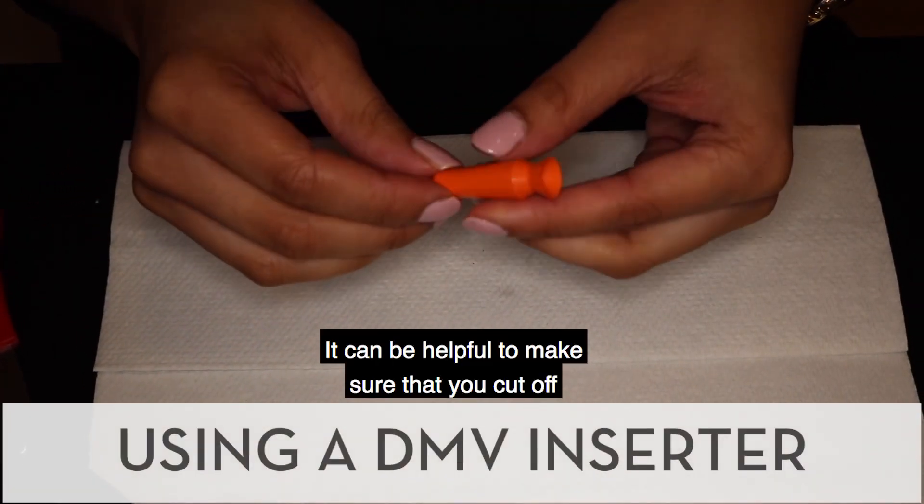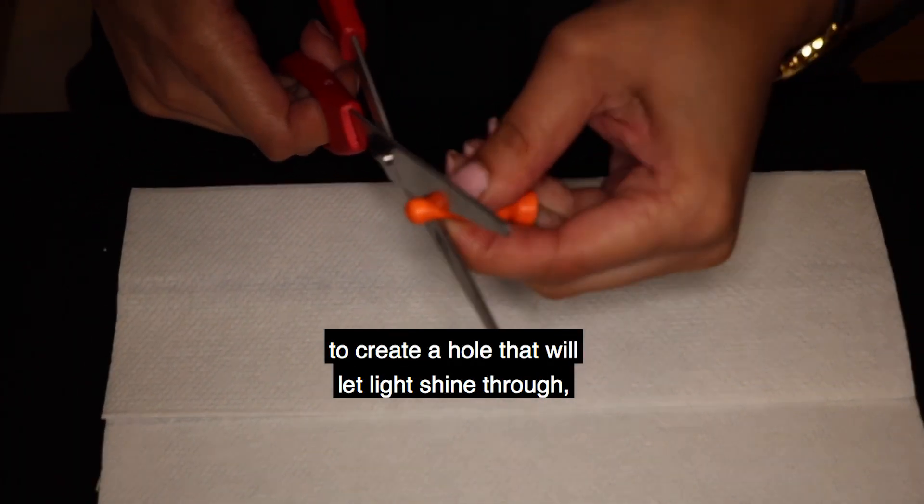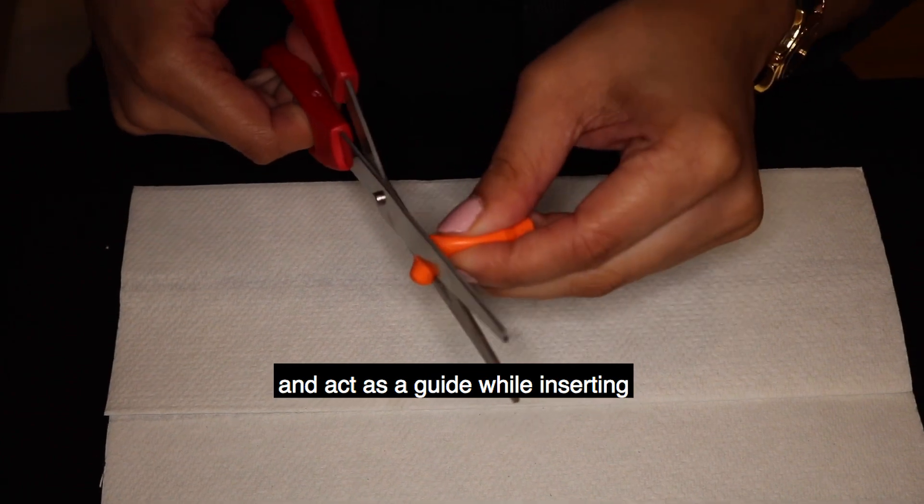It will be helpful to make sure that you cut off a little bit of the end of the inserter to create a hole that will let light shine through and act as a guide while inserting or removing your contacts.